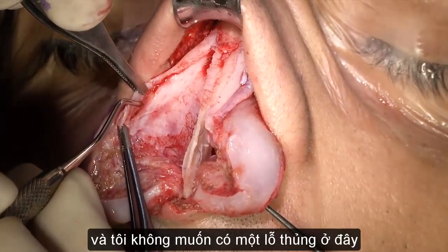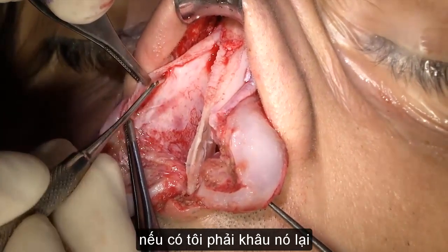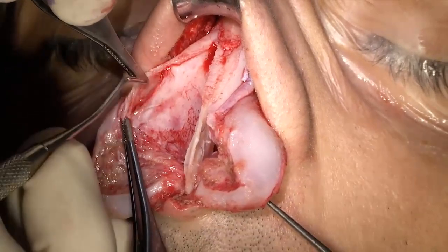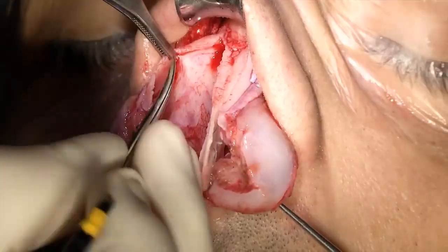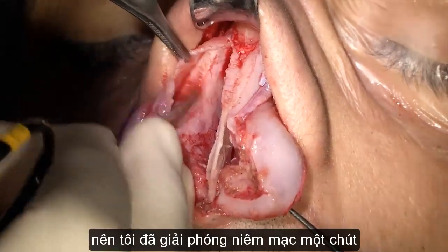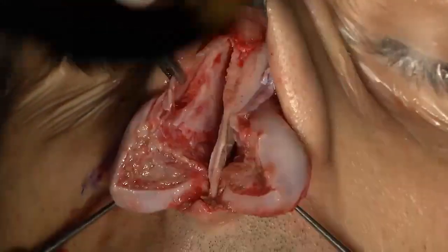And I don't want a hole here. If I have a hole, I will suture it, of course. But I'll just try not to have one. Okay, so I freed the mucosa a little bit here.